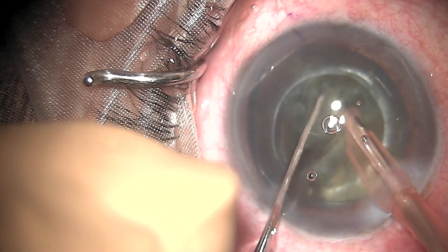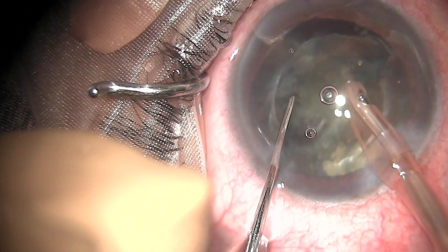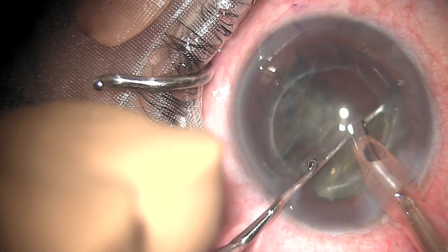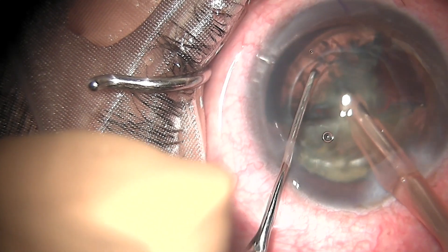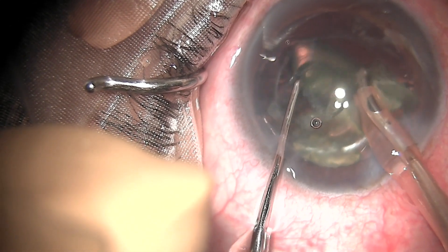After the central crack is complete, I am removing the hemipieces segment by segment. The segments are pre-chopped, so removing them is much easier. You can see that I am very easily able to separate the segments and remove them.